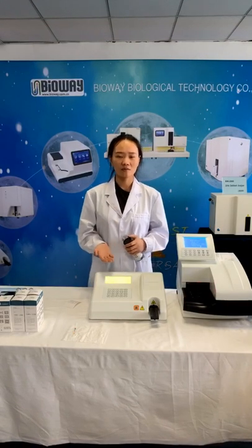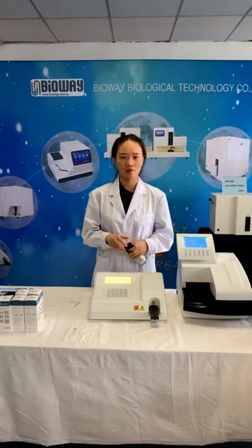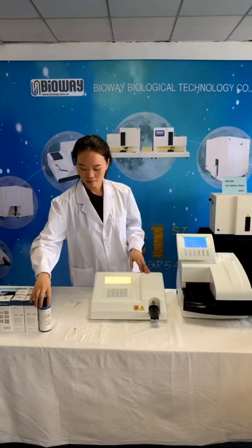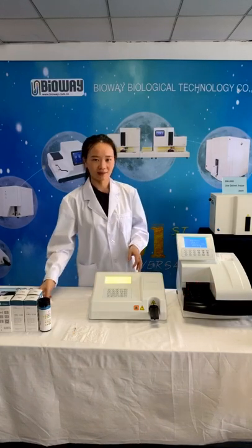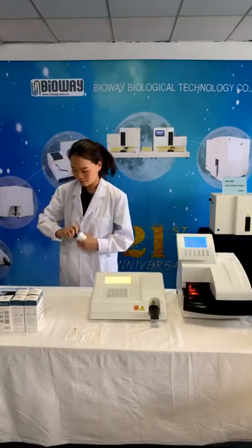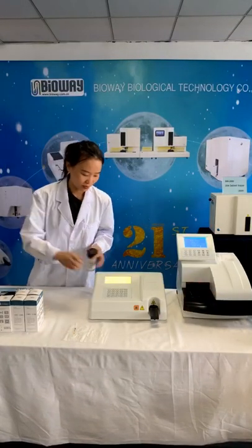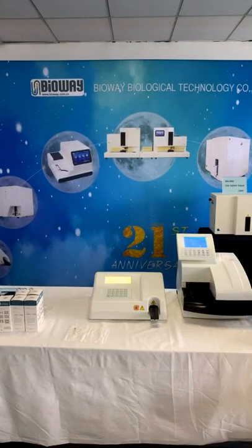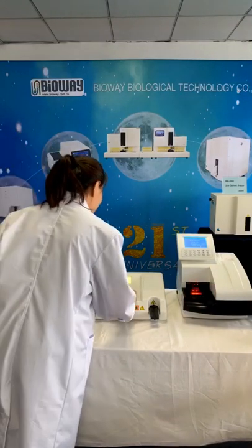And just as we said before, you can choose a single test mode or continuous test mode. Later, I will show you how to use the continuous test mode. It will be faster than a single test, and it will save lots of money and time. Before the test, we have to set the correct menu to test the function.